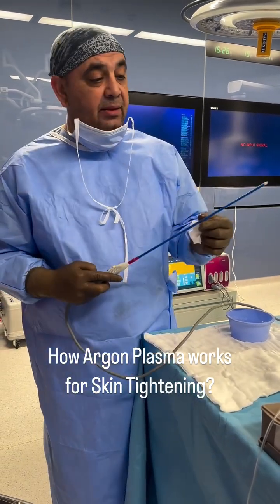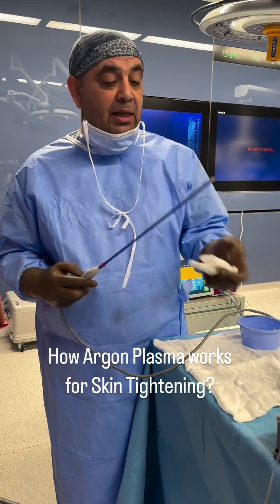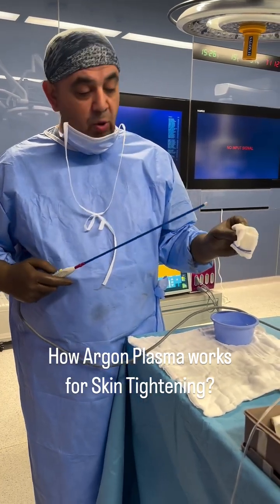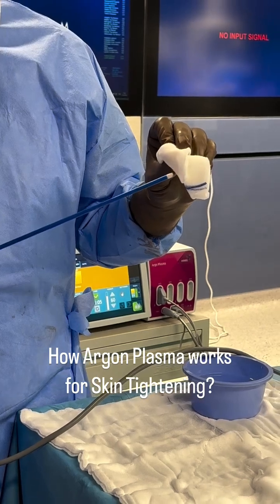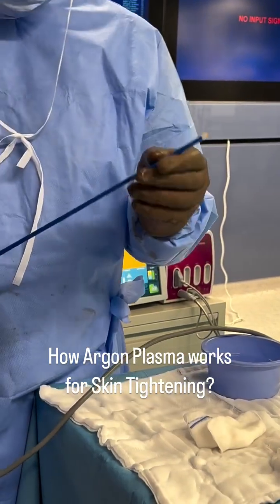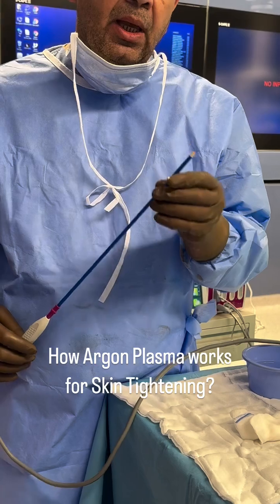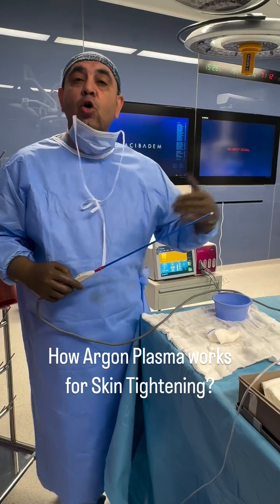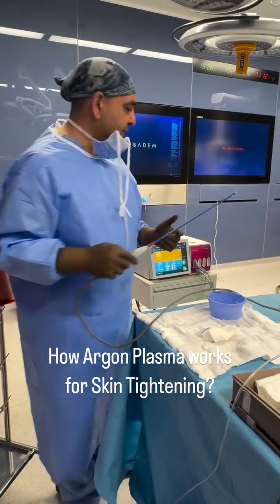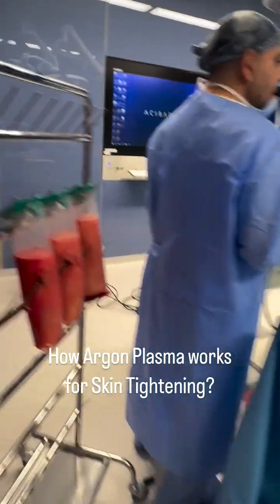This is the handpiece, and this probe is a single-use probe. When I push the button, you can see the plasma energy is delivered from the tip of the probe. It also delivers argon gas to cool the skin during surgery.